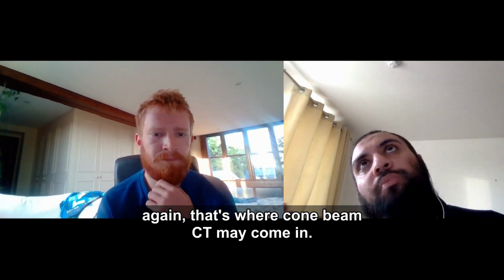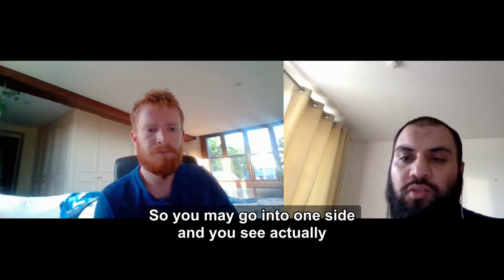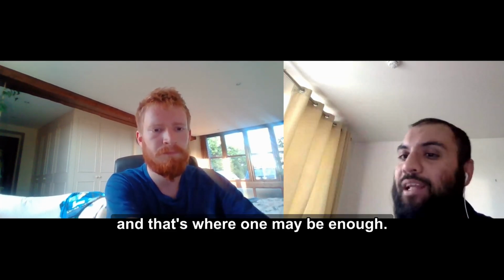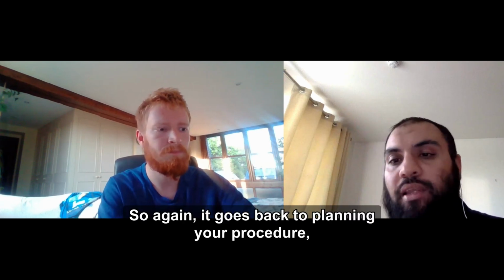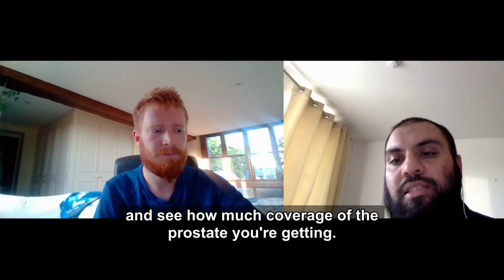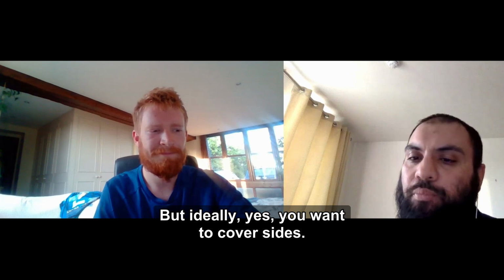Again, that's where cone beam CT may come in. So you may go into one side and you see actually it's covering a large amount of the prostate, and that's where one may be enough. So again, it goes back to planning your procedure. It goes to the use of intra-procedural cone beam CT and seeing how much coverage of the prostate you're getting. But ideally, yes, you want to cover both sides.